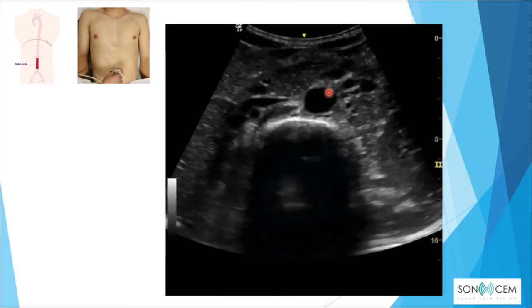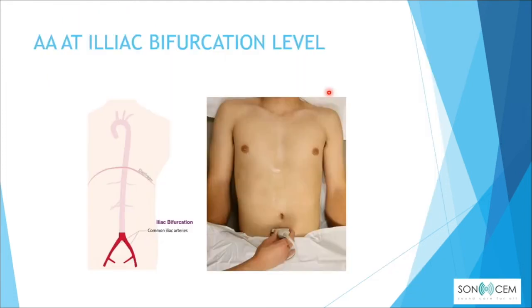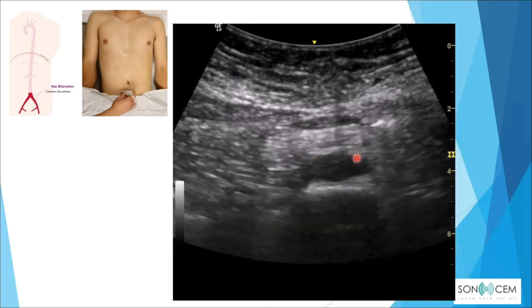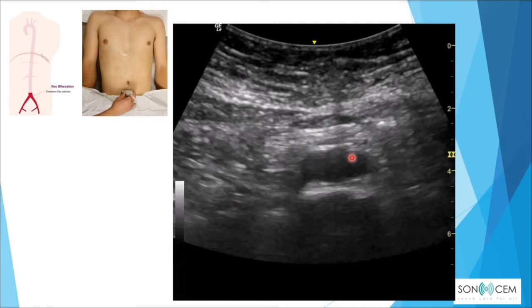This is the ultrasound clip of the aorta at the distal level. Moving further down to the bifurcation level, we can see the aortic bifurcation into the common iliac arteries. To measure, freeze the image and measure either the right or left common iliac artery, remembering that the diameter should not exceed 1.5 centimeters.